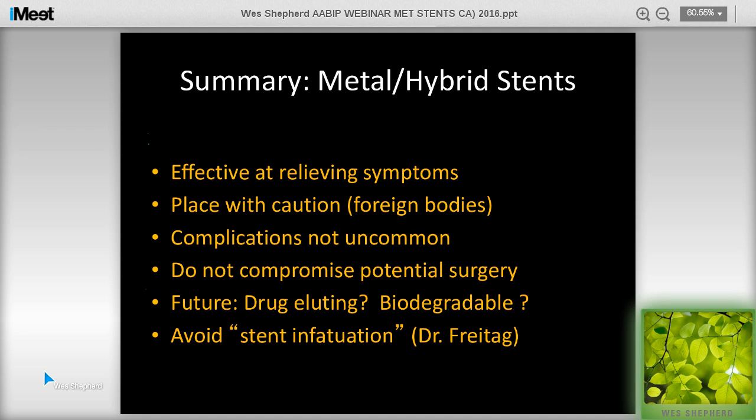I think that's a very uncommon scenario, particularly, again, in malignancies. When we've seen fractures, it's often in patients who've had metallic stents in for very long periods of time, which, again, used to be more in the benign population. Obviously, we're not seeing many benign patients who still have metal stents left in this day and age. So I think it would depend on how much the integrity of the stent is compromised.